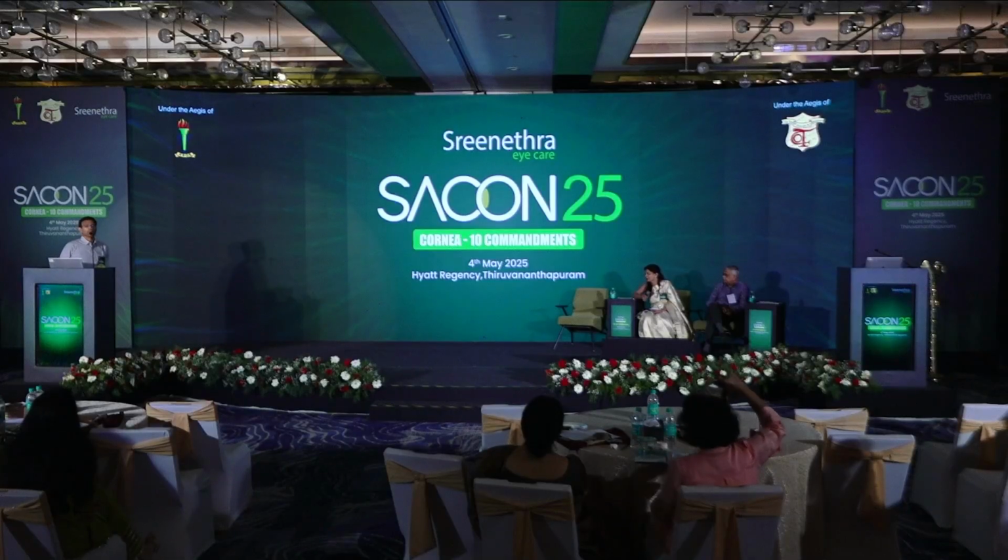Could you please tell the audience why not below 40? Yeah, because the endothelium, as I told you, scrolls on itself. The hemidesmosomes are very tough. The collagen is stronger. So generally we take above 40. That's why in PDEK or any other DSEK we can take young tissues. But in DMEK it is only above 40 because the scroll is very difficult to unfold. It becomes a very difficult scroll.